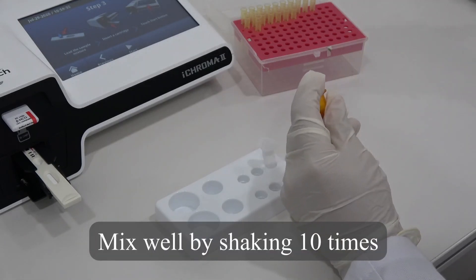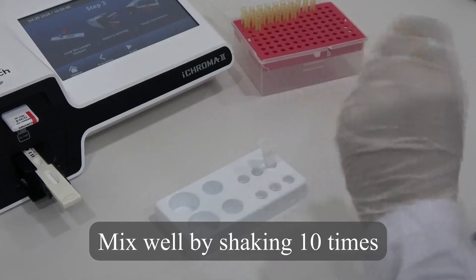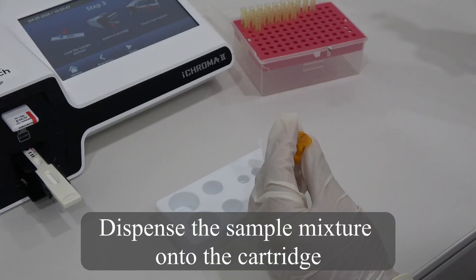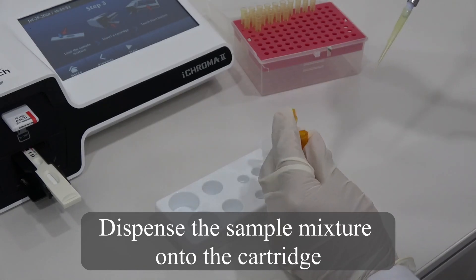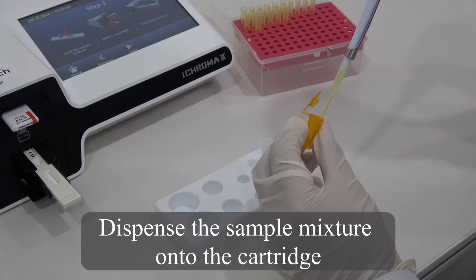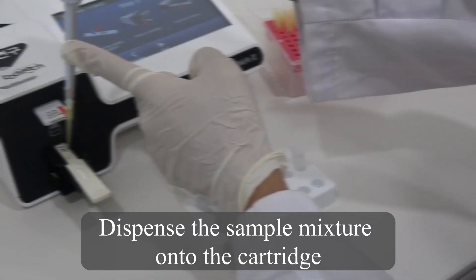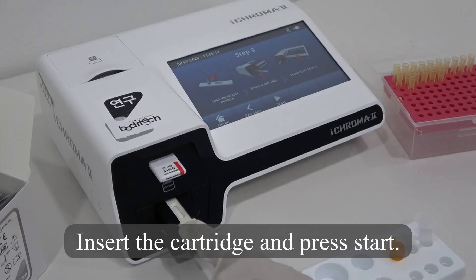Mix well by shaking 10 times. Dispense the sample mixture onto the cartridge. Insert the cartridge and press Start.